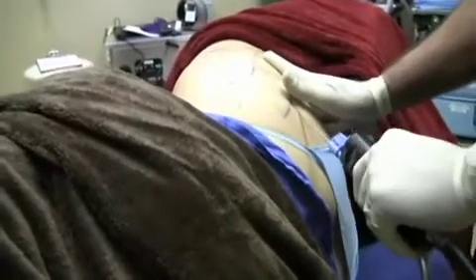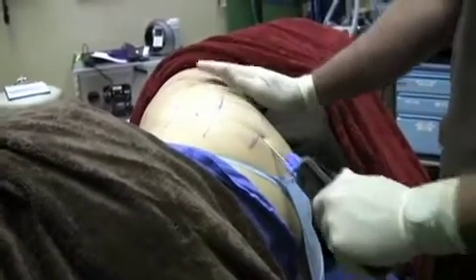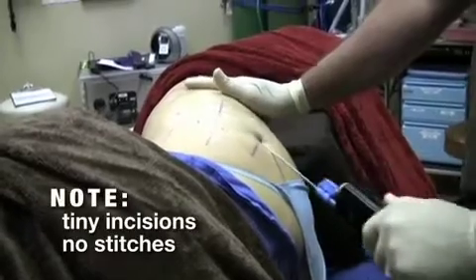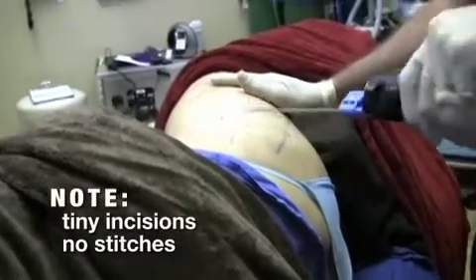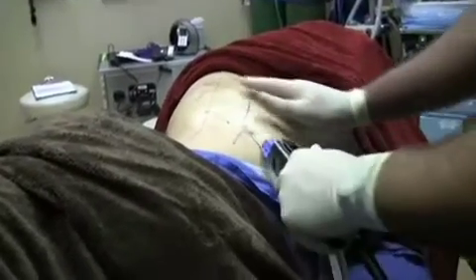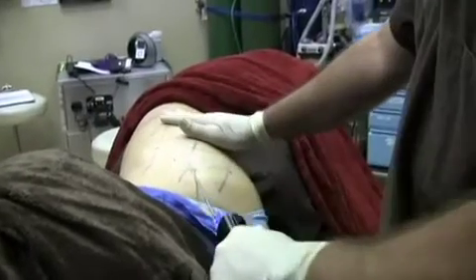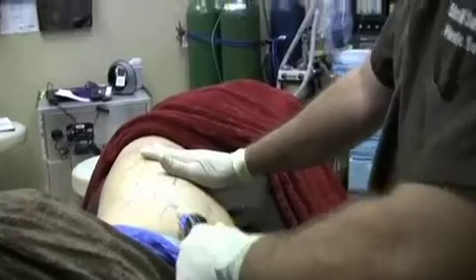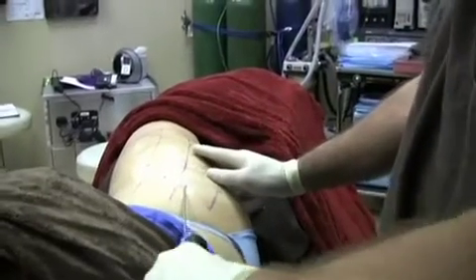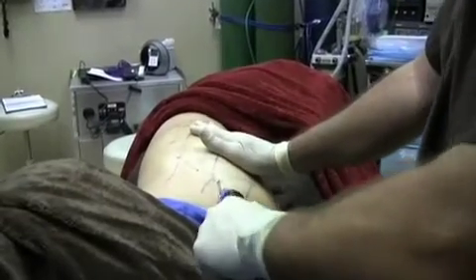But you don't see any red, which the lateral thigh is usually like this. The flank, sometimes we'll get some red areas. It's a little more vascular and fibrous. You want to suction through all of the holes. You don't want to keep going in the same direction. You minimize any contour issues. And you can see as the cannula advances, it'll hit a fibrous area and bounce off of it. It's not sharp.